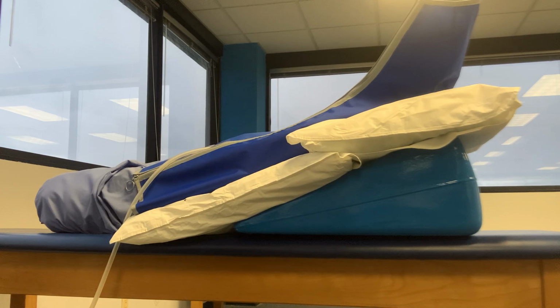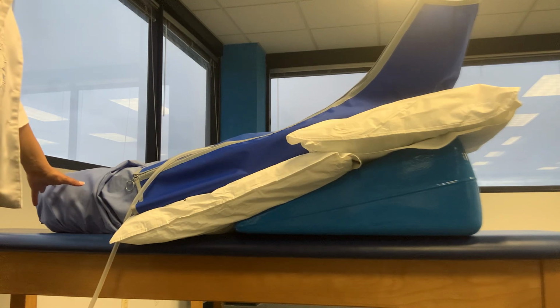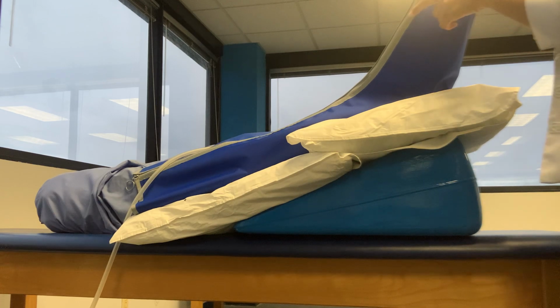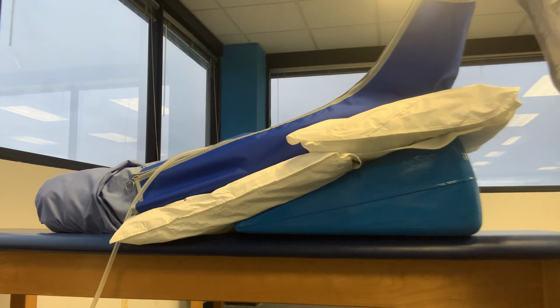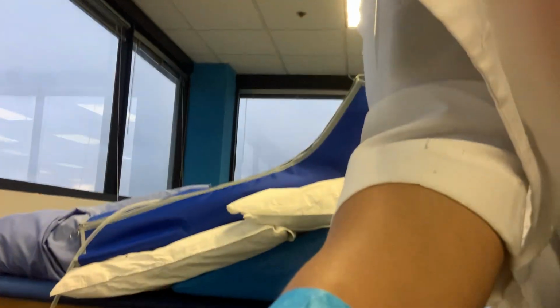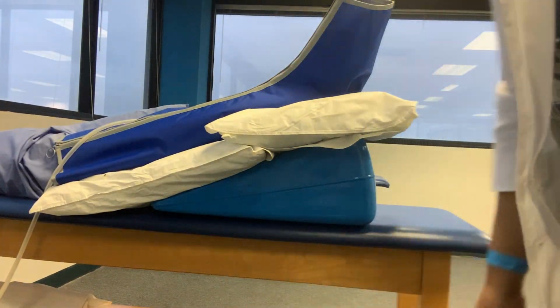So this is where I would have to check with my patient during that first inflation. Are you doing okay? So I allow the machine to inflate, and then I find out if they're doing okay. Then the other thing I need to do to see if the patient is tolerating it well is I'm going to come to the end here. I'm going to bring it up so you can see. So that was the end of my first inflation.